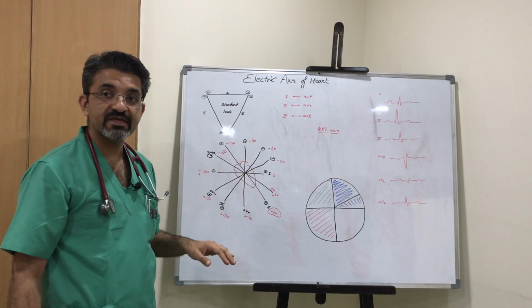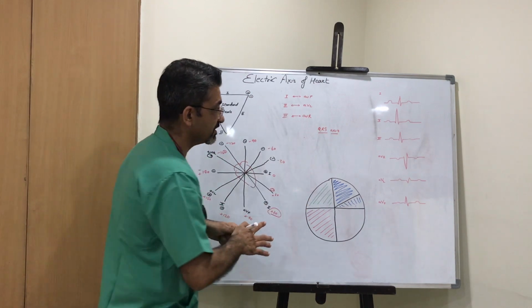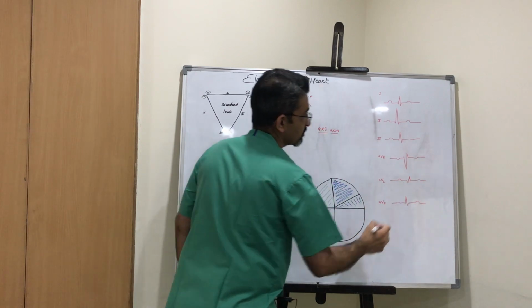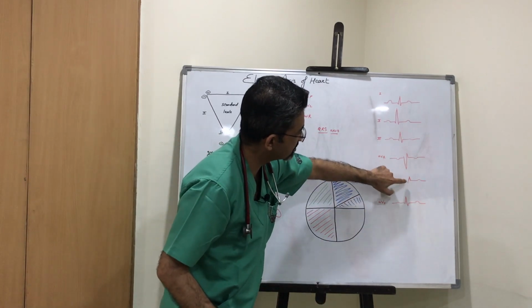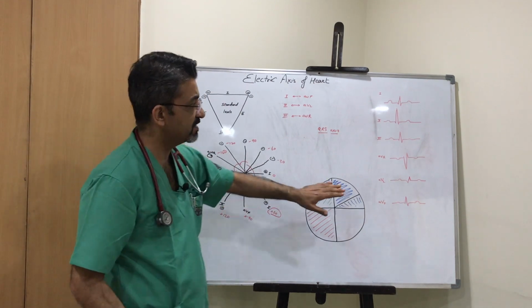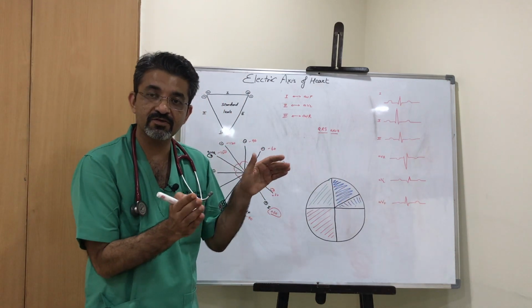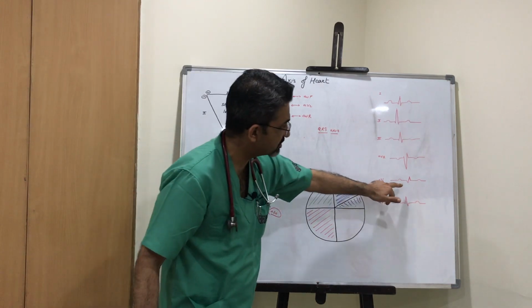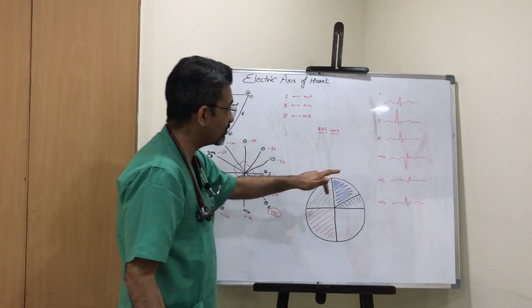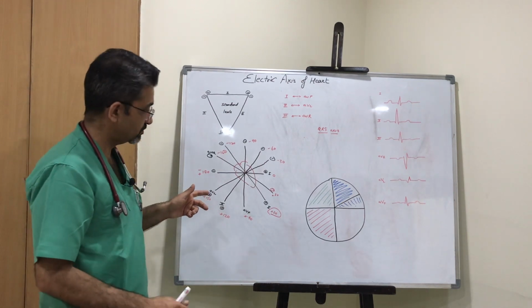There is a possibility that you don't find a QRS complex which is equiphasic. There is a possibility that here it was like this, a slightly more positive deflection as compared to the negative deflection. That's a real possibility. So you again try to find which complex has more or less equiphasic deflection. Again, this is the one which has slightly equiphasic deflection. Now the QRS axis will be where? Question is this.